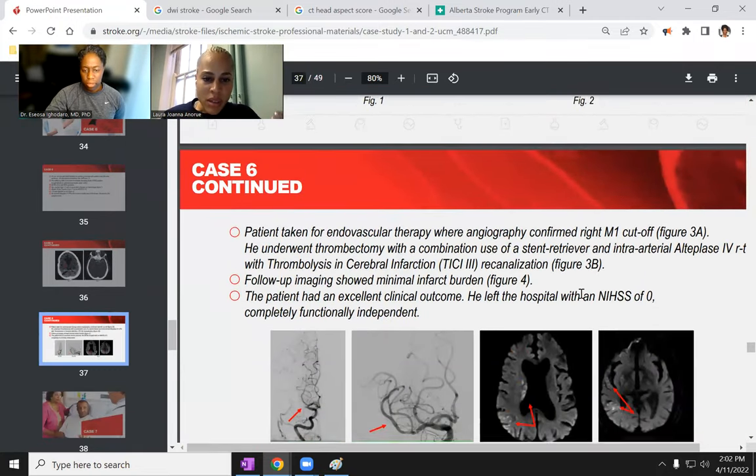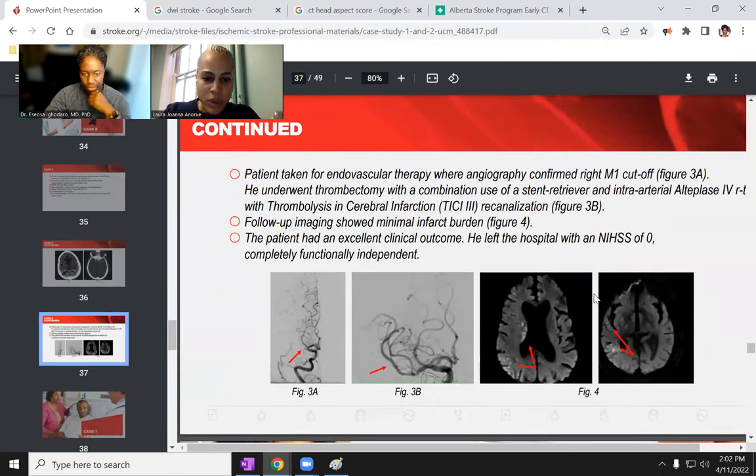So we have, I see the big juicy internal, figure 3B. So we have the ICA. I'm trying to see, I guess the MCA is the most left. Is that the MCA? Or no, yeah, I guess it has to be because that's actually where the occlusion was, MCA. So we have the ICA. Is that the MCA then, where you continued on with your purple drawing?